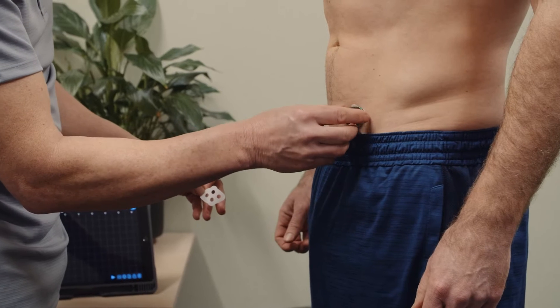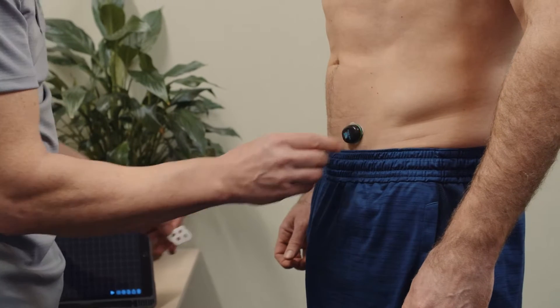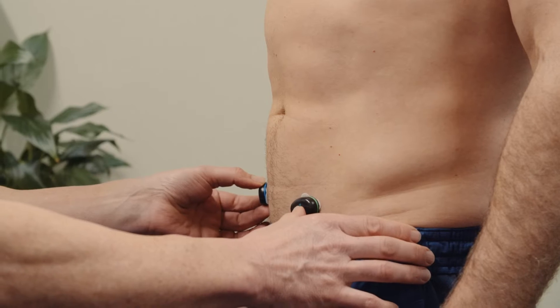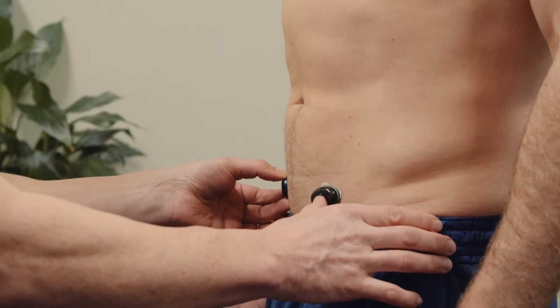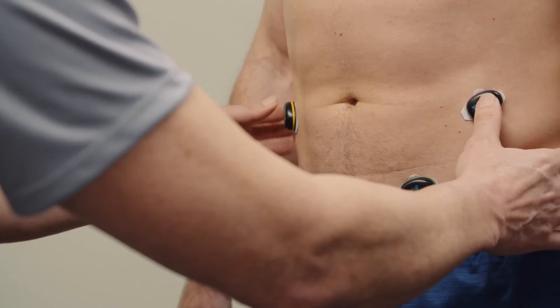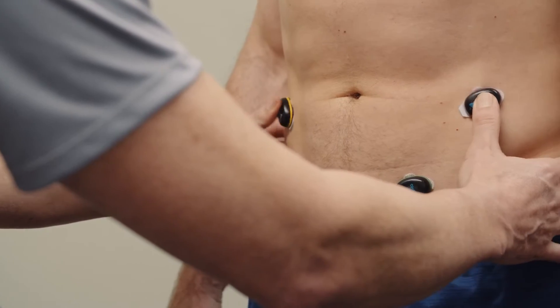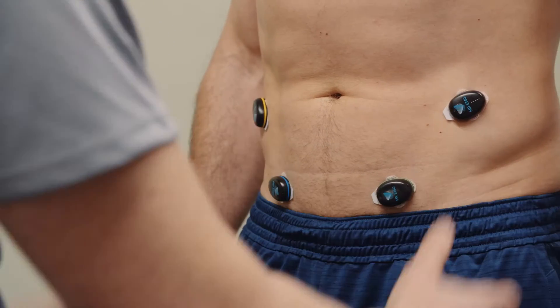Place sensors on your subject's transverse abdominus, left and right side, then their obliques, left and right. Follow our recommended muscle placement sites.